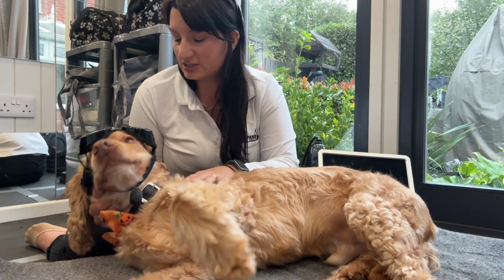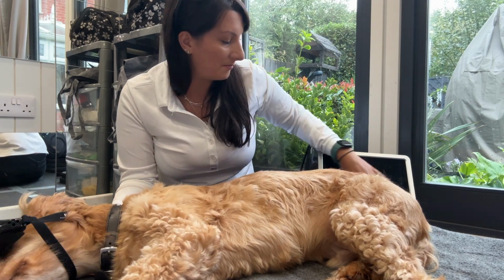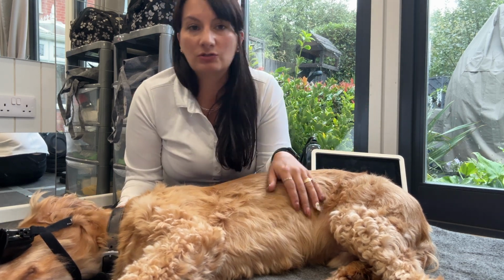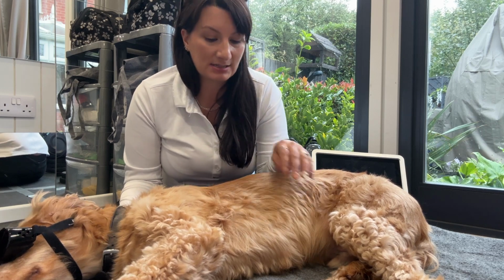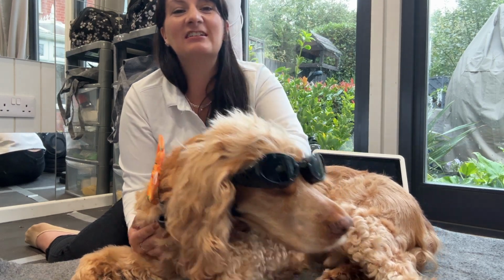Now the biggest challenge is patient characteristics. We talked about that previously in terms of long fur, short fur, coat and skin colour, patient density. We've got a little bit more fat here than we'd like. I know, I just offended you, didn't I?